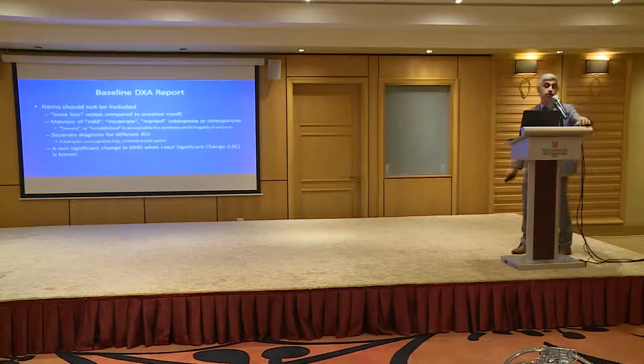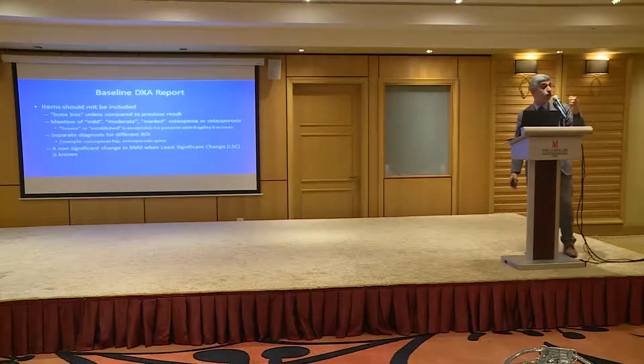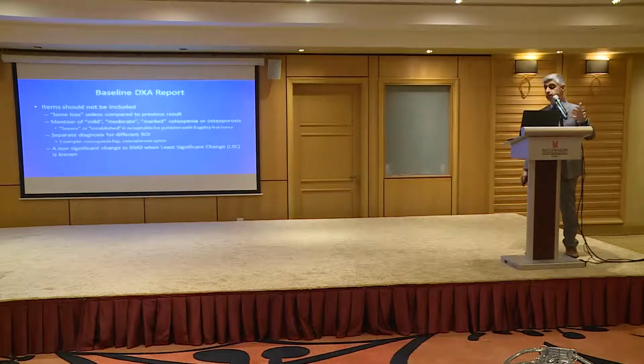What about reporting? Well, you can do your own reporting if you feel confident, but you need to make a good judgment about reports that come to your desk, to your file, and that you know are not correct. One way you can tell they're not correct is if they use terminology that is not appropriate to describe a DEXA scan. For example, it is not appropriate to say someone had bone loss unless you have a comparable result, because you don't know if they really had bone loss unless you show a decrease in the value of their BMD. Otherwise, you cannot call that.